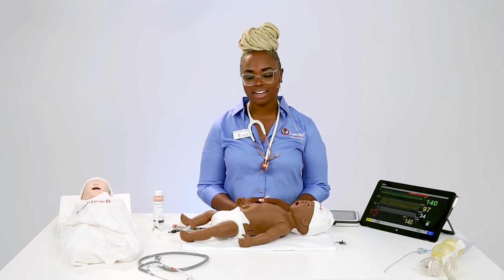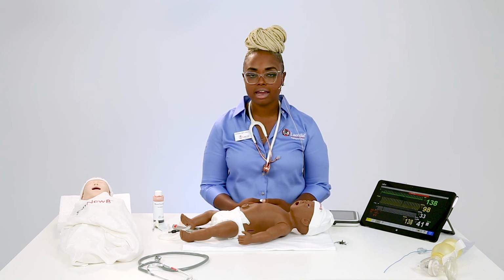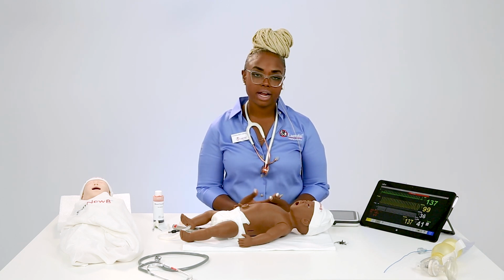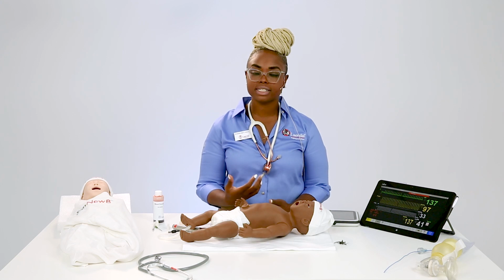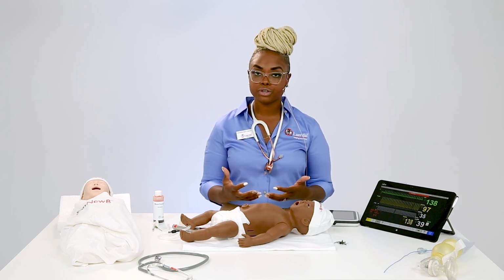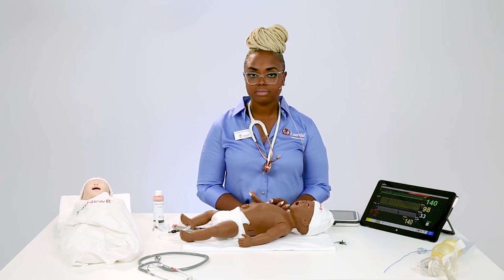There's a follow-up question. Someone asked, can you explain what Leap is? Absolutely. I'm glad you asked. Leap is the interface, or Laerdal learning application, that is utilized to run all our simulation equipment. That is where you're able to run the mannequin on the computer, create scenarios or themes, record sounds, access settings, different monitors that you can look at, access scenario cloud, and do your updates.